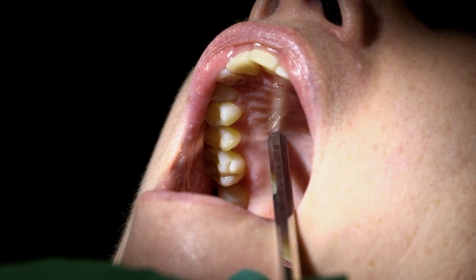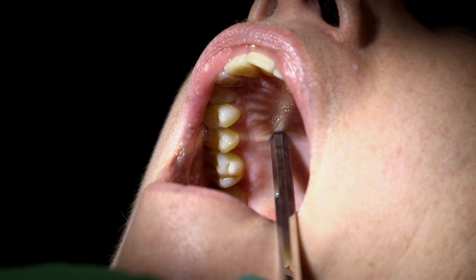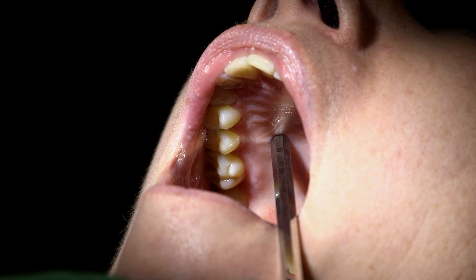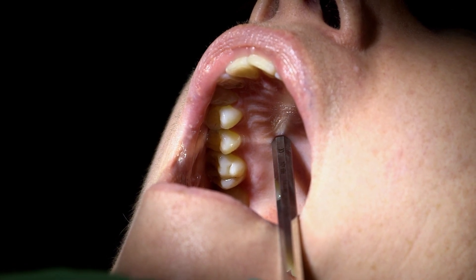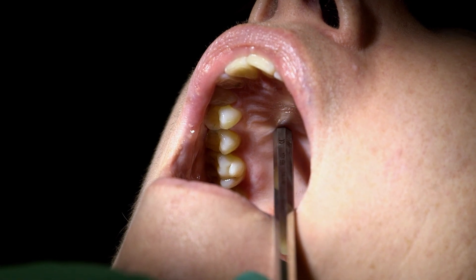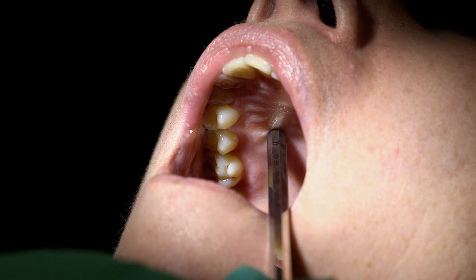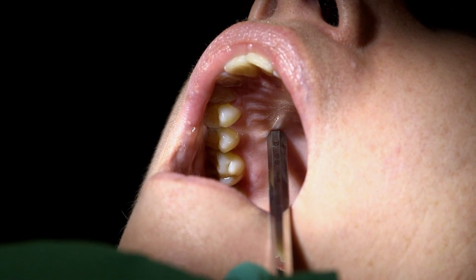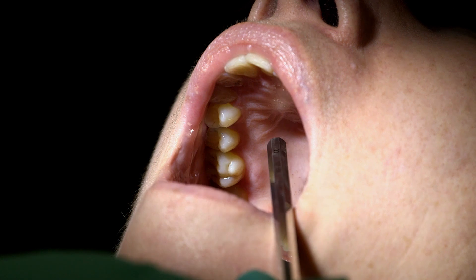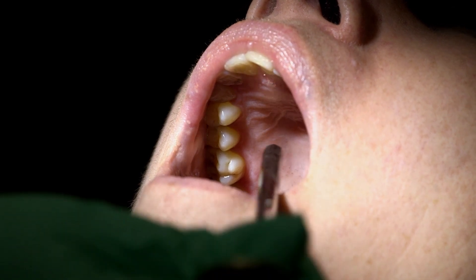Palatal infiltration of tooth 1-4. The target bony site is at the greatest angle of the palate — the junction of the palatine process of the maxilla and the alveolar process of the maxilla. You also need to identify the soft tissue landmark at the maximum tissue thickness of the palate. The syringe should be oriented so that the needle is inserted at approximately a 45 degree angle to the palate.